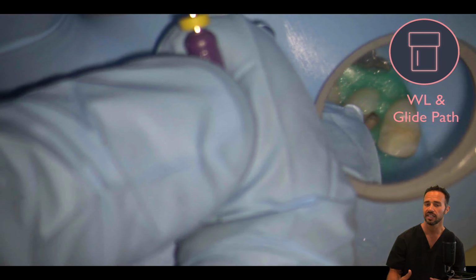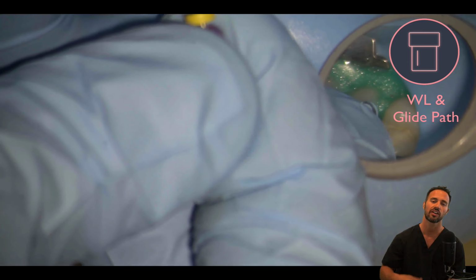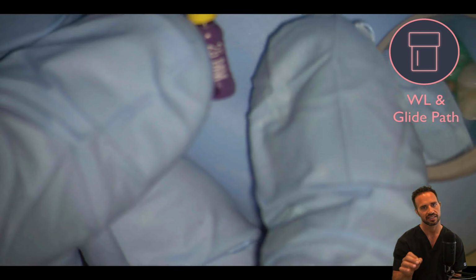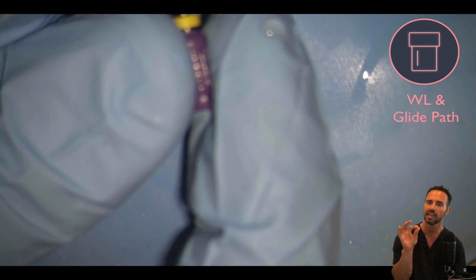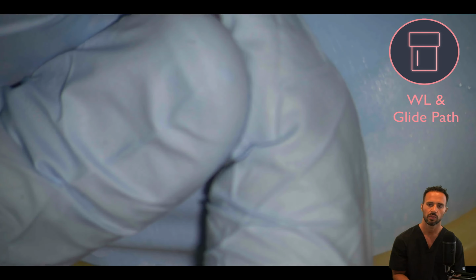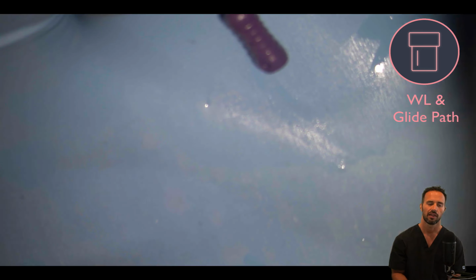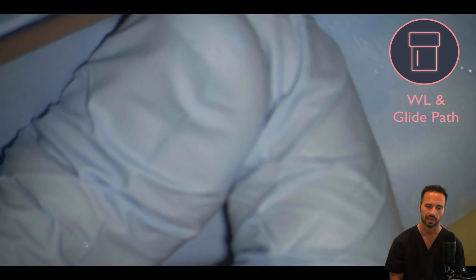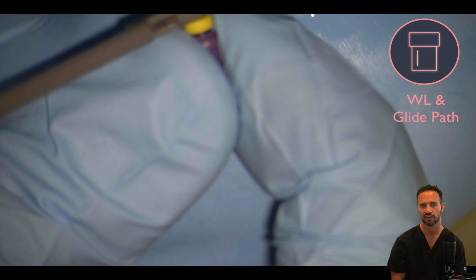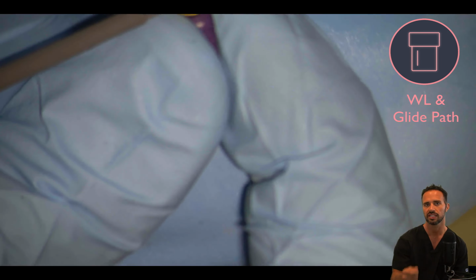All right, so now we're proceeding to our working length determination and our glide path preparation. So we got our size 10 C file in there that's being introduced into the buccal canal, and we're just utilizing a watch winding motion. It was initially described back in the late 80s as the balanced force technique, but it's essentially just a watch winding motion of the hand files to progress to the apex. And we're just passing that 10 file down. If the 10 file is not progressing to the apex, then by all means go down to an 8 file to make sure you get to the apex.